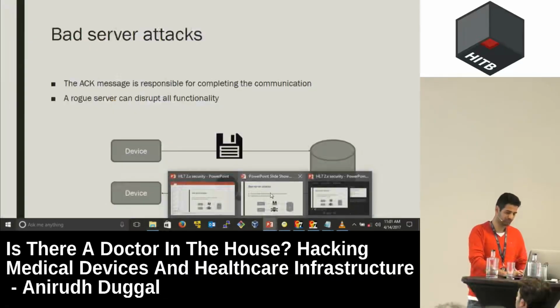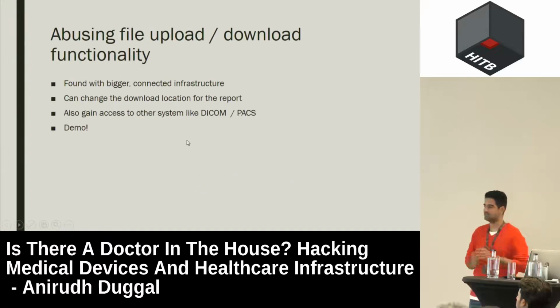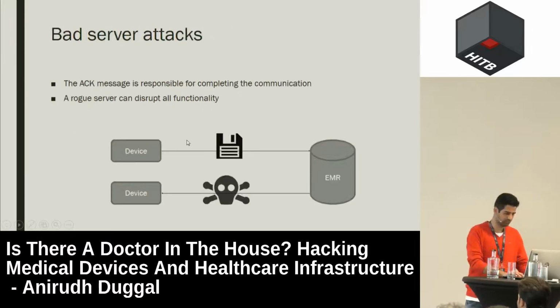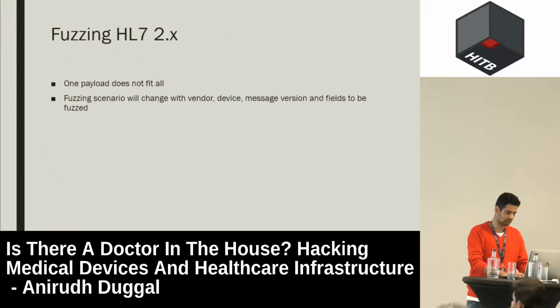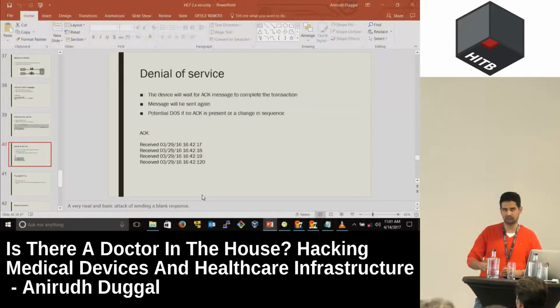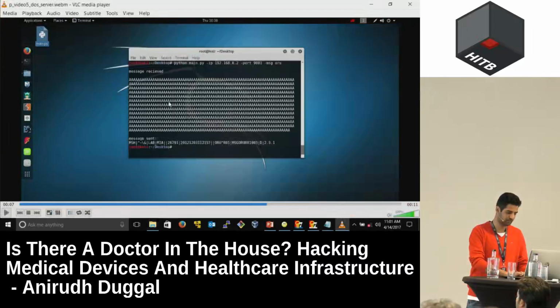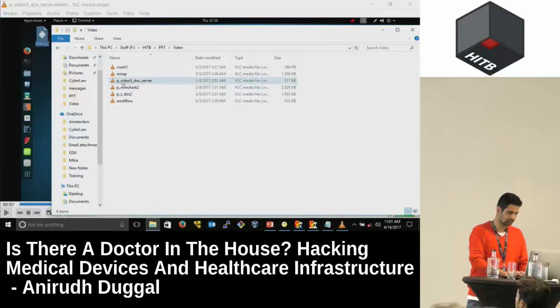Let's talk of more bugs. Let me show you a whole DOS attack, and this is a very logical DOS. If you have access to this EMR system, this is how you would actually hijack all the streams and crash everything.